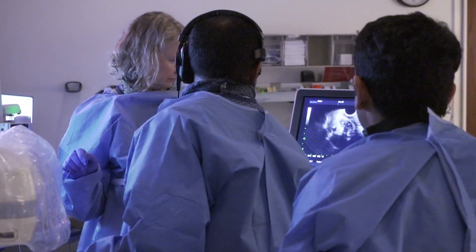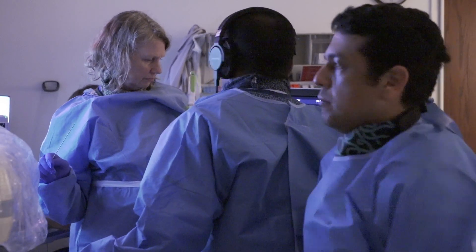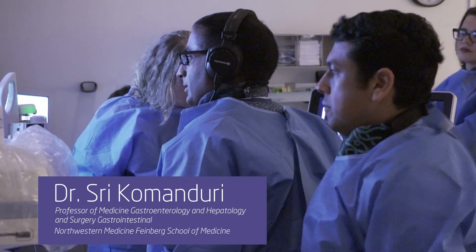All right, thank you, Raj. We're going to switch back over to Sri, who's now doing endoscopic ultrasound on this patient. Can you hear me? Yes, Sri, we can hear you, and we can see endoscopic ultrasound images.